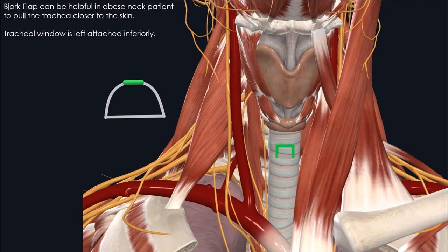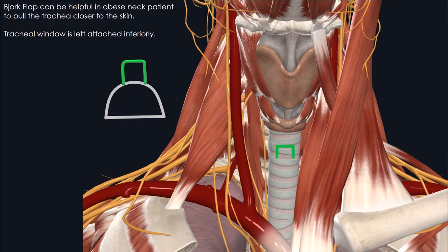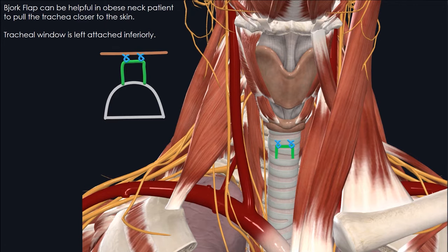Another commonly used approach, especially in obese neck patients, is to use a Bjork flap. When the cartilage is cut, the inferior ledge is left attached and then the superior margin of the cartilage is sewn to the skin to create a stable opening that can be maintained if the tracheostomy tube is ever dislodged. An additional benefit is to pull the trachea up superficially towards the skin, which can be a helpful feature in patients with a very large neck.